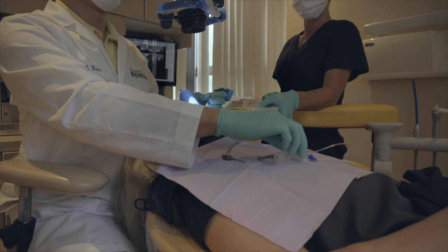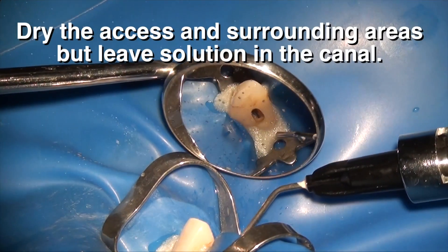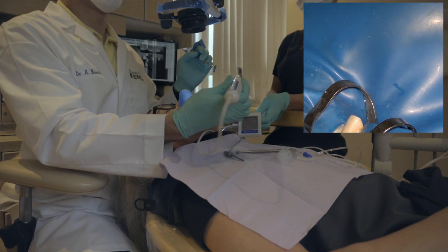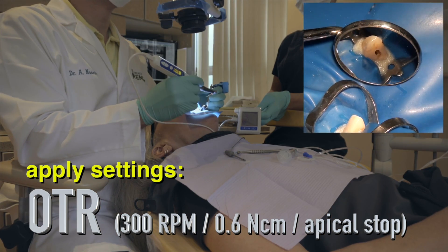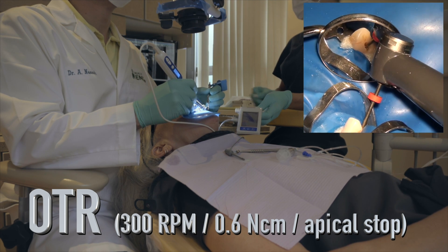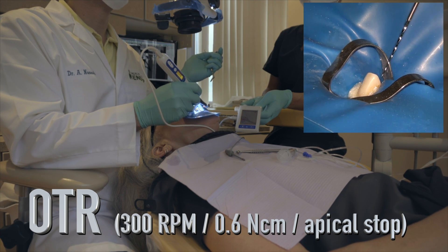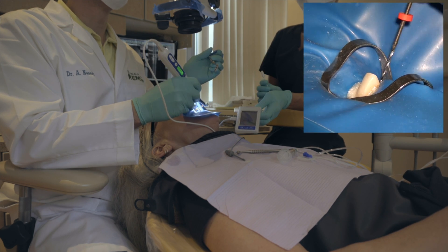Once you've done your coronal instrumentation in the crown-down direction — phase one — you flood the chamber with hypochlorite and then remove the hypochlorite from the chamber, leaving hypochlorite in the canal. You then air-dry any remaining fluids to prevent a short circuit. The settings for phase two are 300 RPM at 0.6 Newton-centimeters with the apical stop. With the handpiece on auto start and auto stop, as soon as you go inside the tooth the handpiece senses it and proceeds to rotate — 300 RPM going down, using either SSC or the rhythm motion to make sure your file is being cleaned.